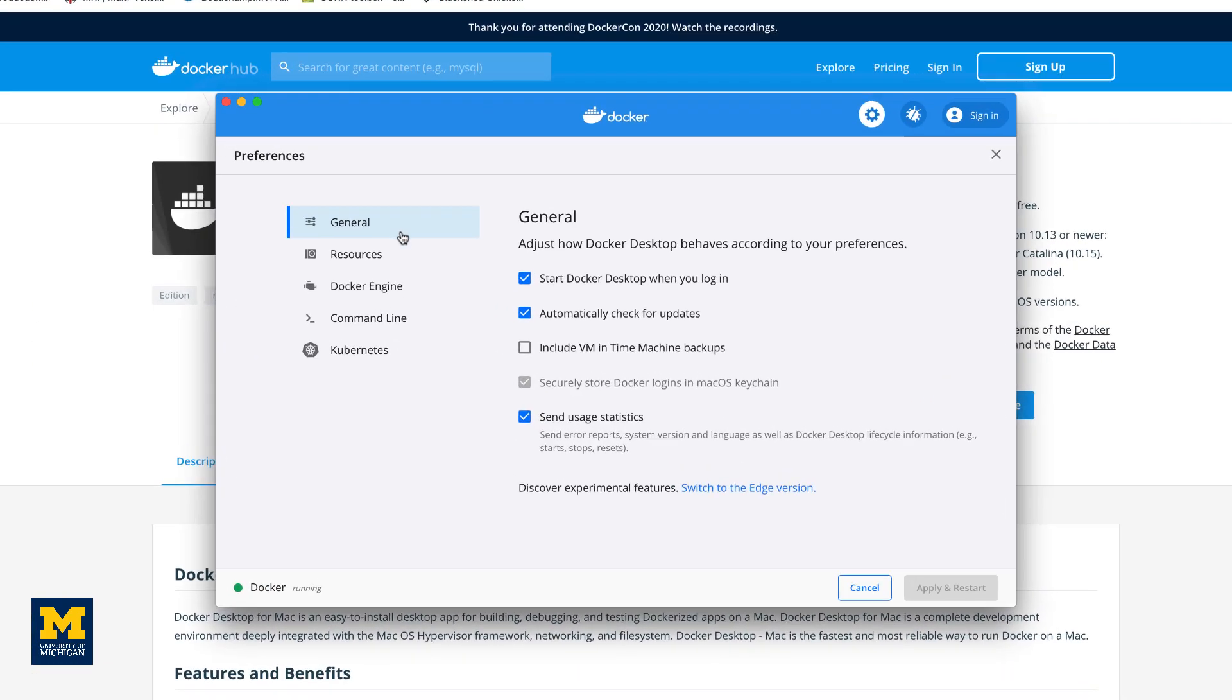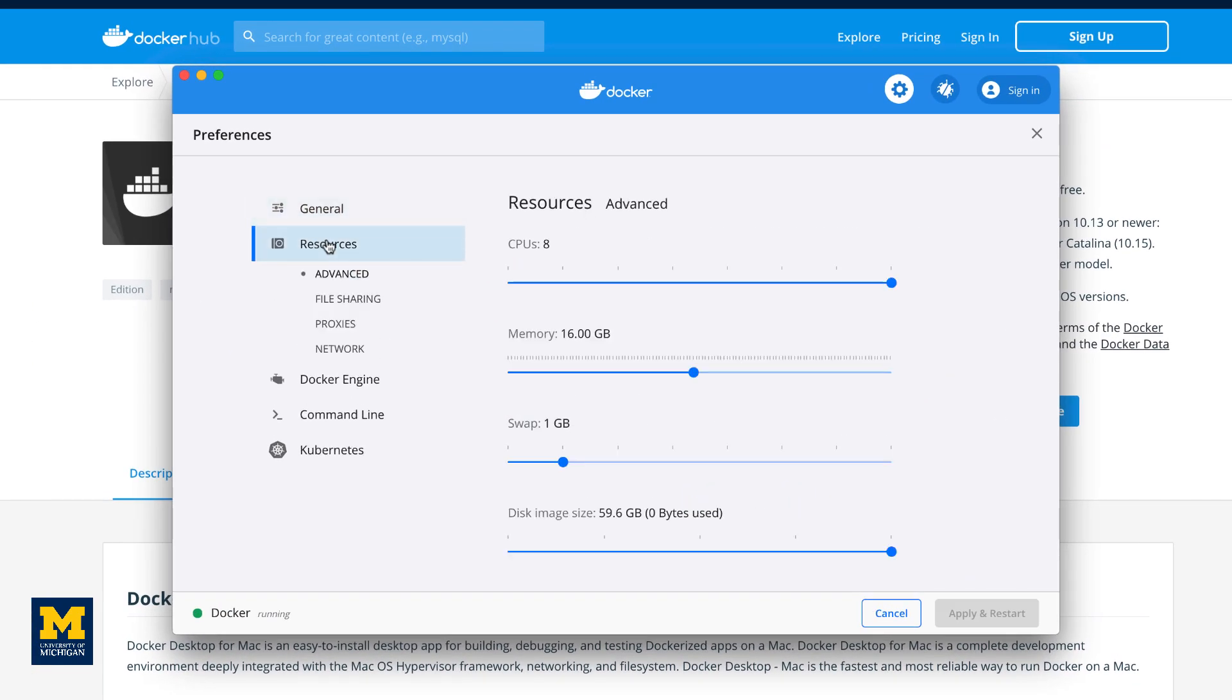You can choose how much memory to let Docker use. It is recommended that you give it at least 8 gigabytes of memory, and at least a couple of CPUs. The rest of the defaults should be fine.